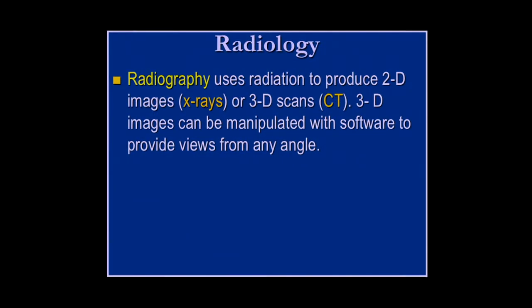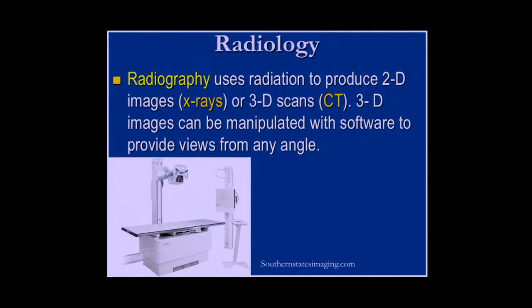I'm going to talk about general radiology, CT scans, X-rays, get into MRI just a little bit, ultrasound, and then I'm going to focus more on the nuclear imaging part of it, which is what I actually know something about. Radiology, or radiography, uses radiation, X-rays, to do 2D imaging if it's a simple X-ray, 3D imaging as in a CT scan, and you can manipulate this data from multiple angles, and you're going to hear more about image manipulation next week.